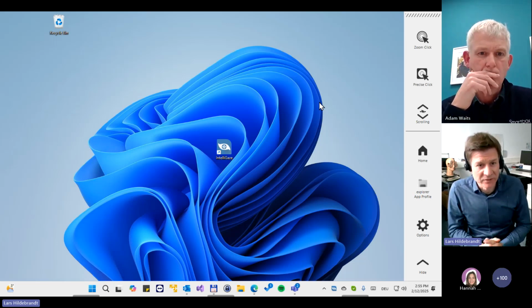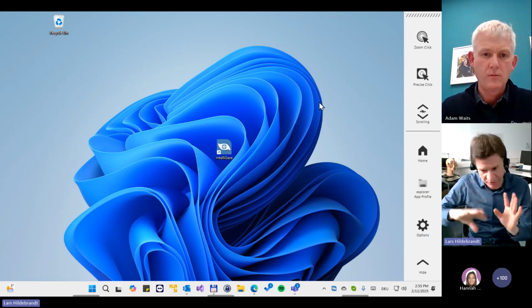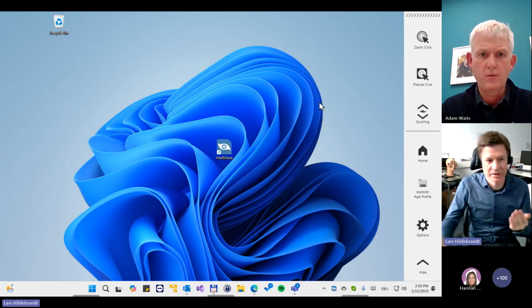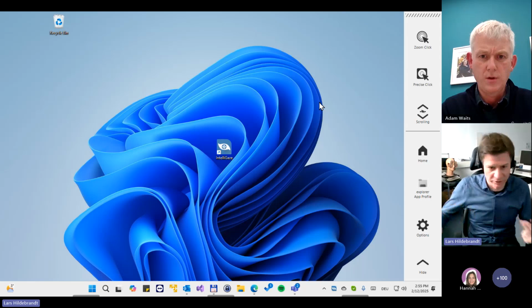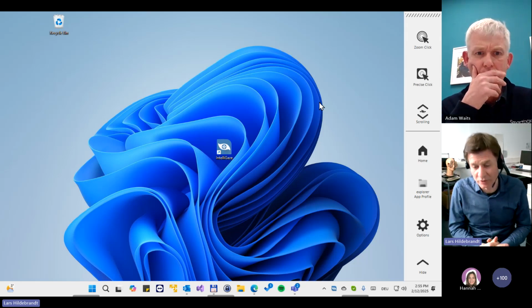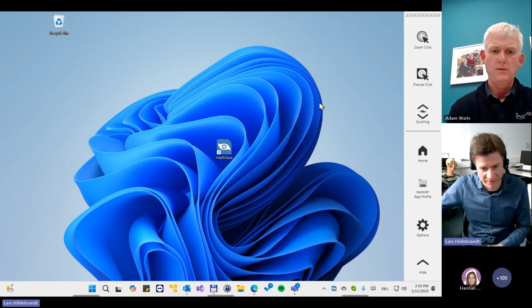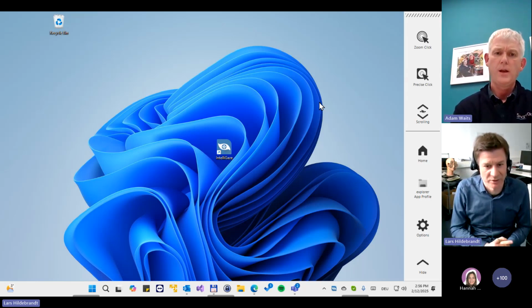And I think it even does it in the background, that if one eye is covered, it waits, and after some time, it just picks up the eye which is not there. But what you don't get in Grid is a detailed analysis of which point it was stuck at later on, so that you can draw your conclusions from this. Therefore, again, it can be useful to at least know how to calibrate with IntelliGaze, because you catch the last 10, 20, 25% of the users who are challenging with IntelliGaze, which you can't do in Grid.